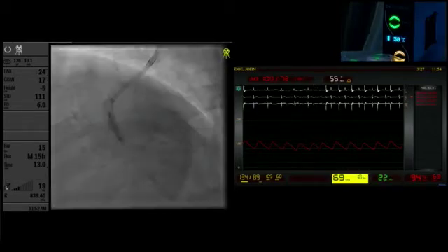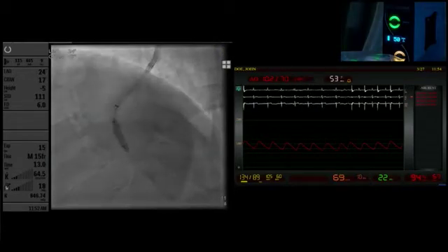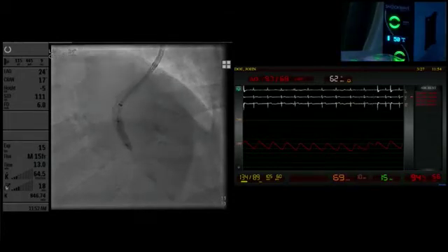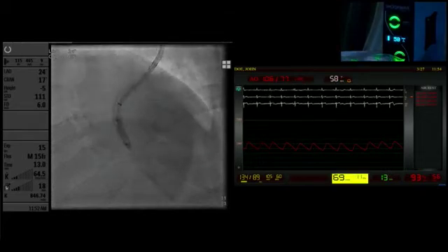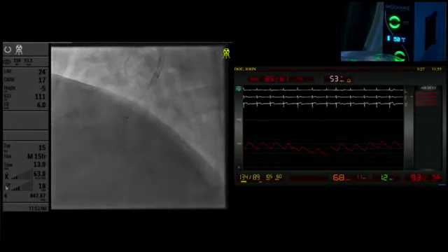I think the official indentation thing is to better say now. Oh, look, that looks much better. Look at the difference, though. Don't you think there is a little bit of a difference? Yeah, definitely. 100%. Yeah, there's a difference. Definitely looks better. How many shocks have we got left now?